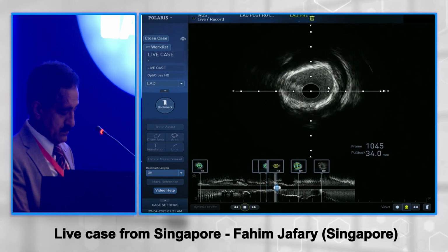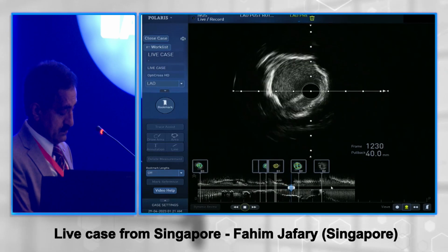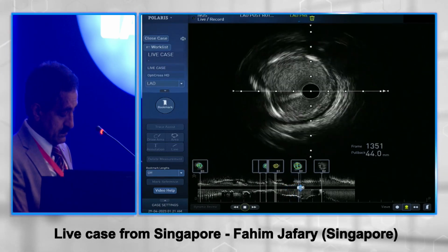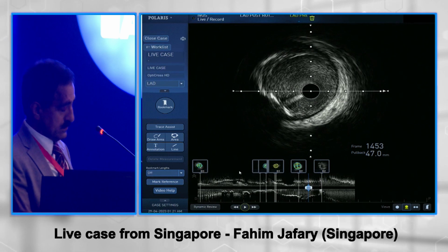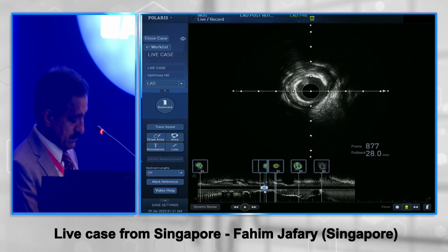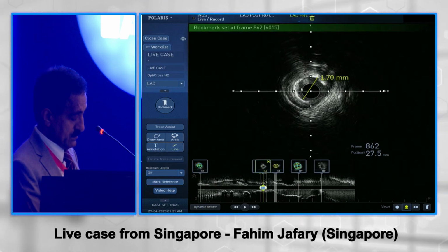And again, concentric rings of calcification. So the lumen gets bigger here. Right. So, Diana, at the tightest part where the calcium is, what is the lumen diameter over there? So this was around the tightest spot that we had. That's about 1.7. Right. Yeah.